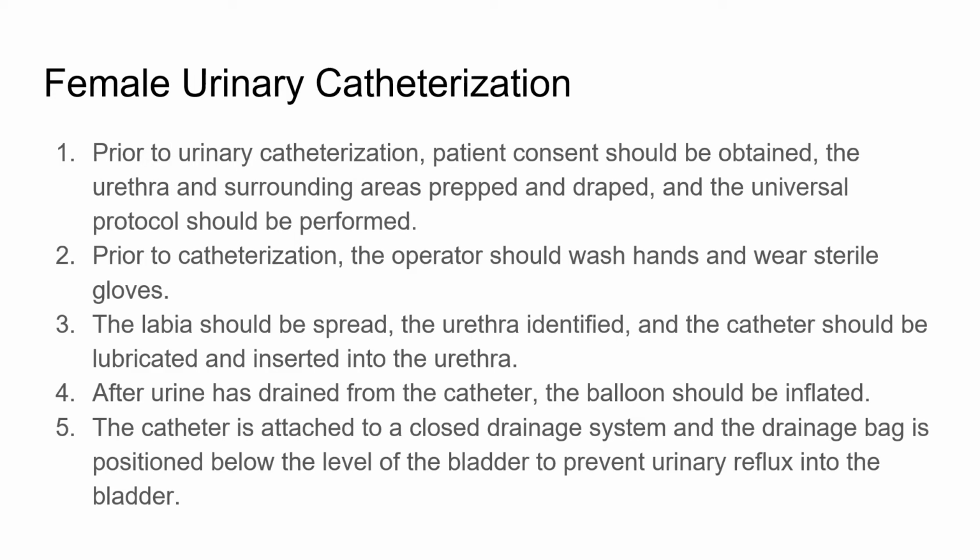So after this, we'll move on to the female urinary catheterization. Just now we discussed the male urinary catheterization. Now we'll discuss the female urinary catheterization. Prior to the urinary catheterization, patient consent should be obtained. The urethra and the surrounding area is prepared and draped. As far as preparation and draping is concerned, the universal protocol should be performed.